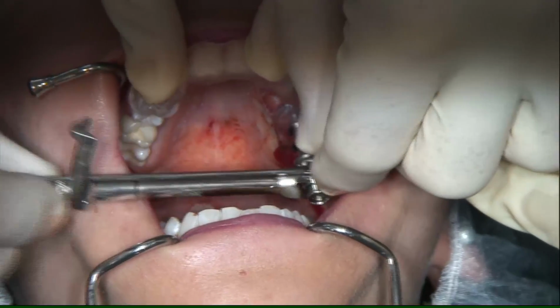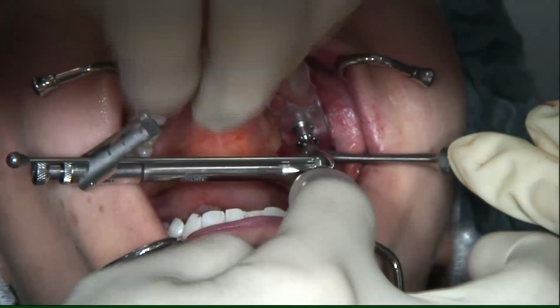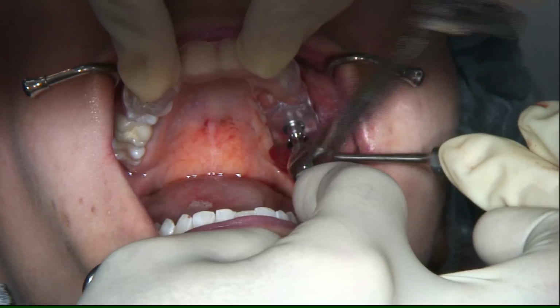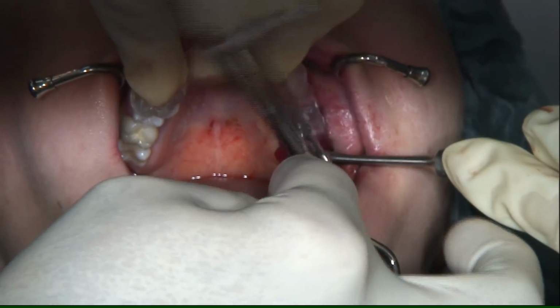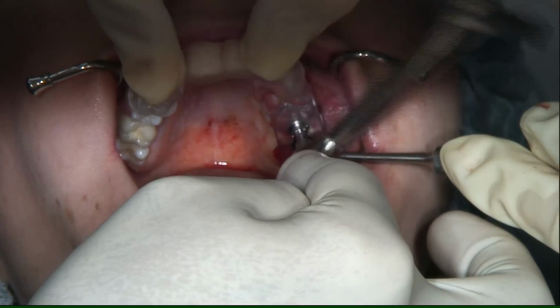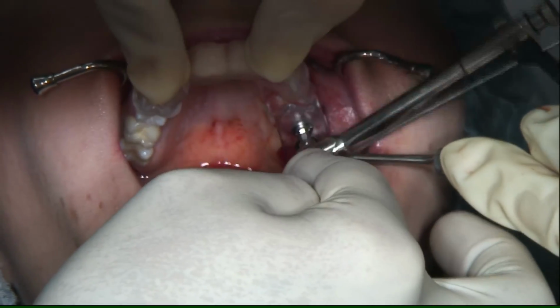So when we are planning the implant, we can see the perfect angle before. Regarding backward planning, we can plan the exact position and the depth. But what we don't see in the CBCT is the bone density. Like I said before, it really depends on the bone density.